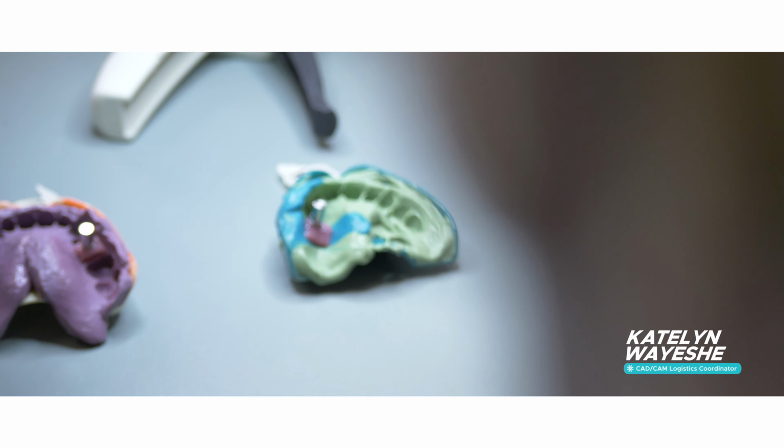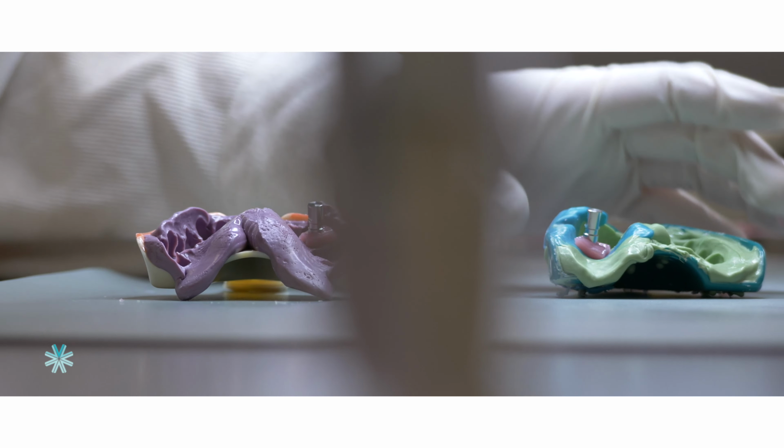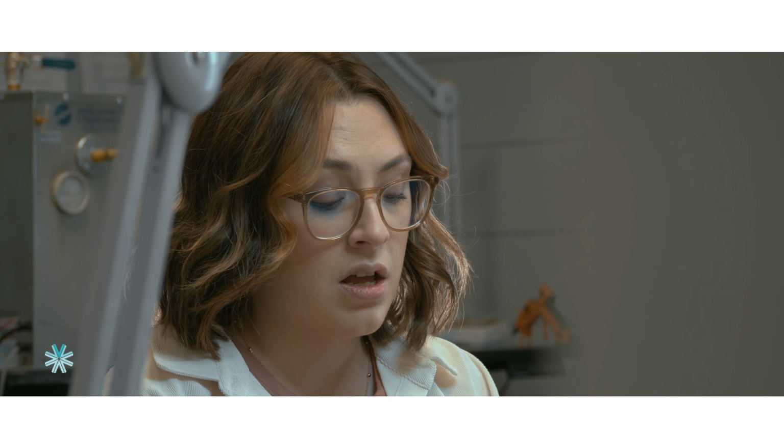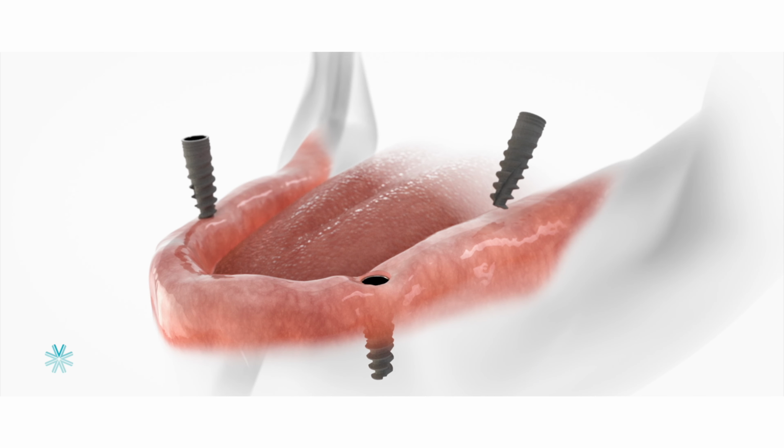The goal of soft tissue is to be able to put an analog on the impression coping that was used to take the impression. This helps mimic the patient's gum line, so we're able to tell what angulation the surgeon placed the implant, how deep or how shallow the implant is.